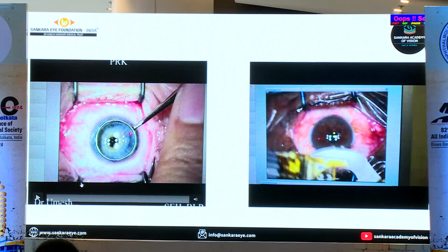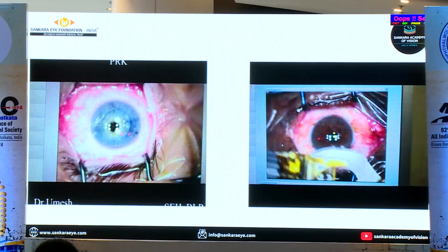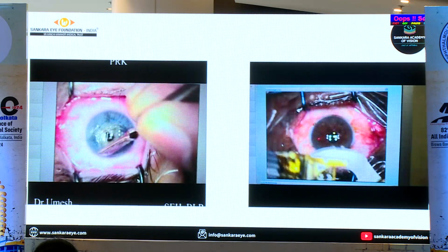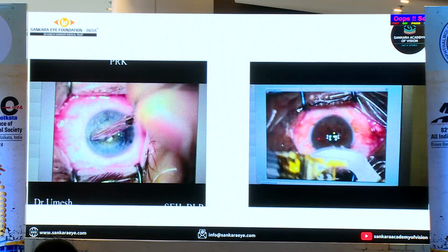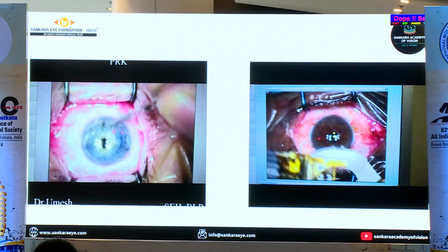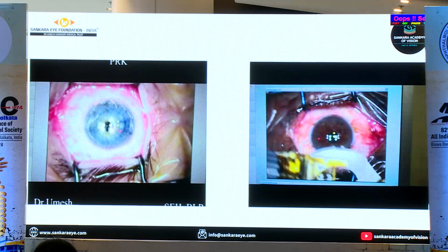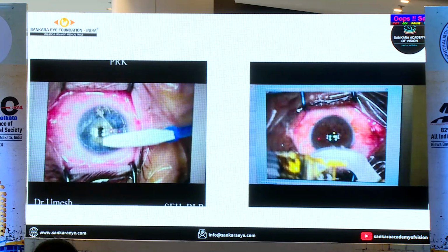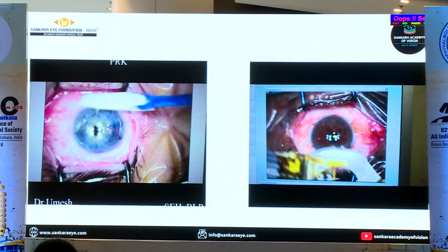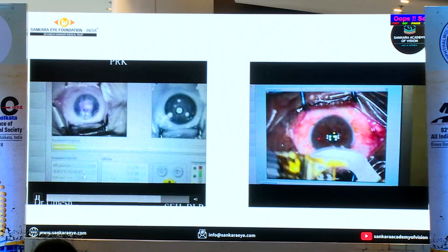So here is a case where the patient, the other eye I had done, this is an ACIOL, he had a -4 residual, the other eye we had emmetropia. So he wanted correction on this eye, was long back, ACIOL. I think PRK surface ablation is easiest. If you have some facility, even any one of you can go ahead and do it, just scrape the epithelium, and patients are invariably very happy. Only thing is, make sure that the pupil is round so that you don't have dysphotopsia post-op. The patient was doing quite well there. That is for a patient with ACIOL.